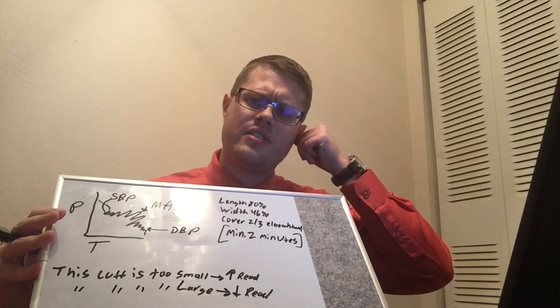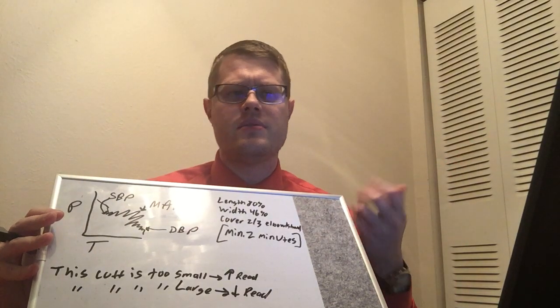The cuff with its tubing connections obviously shouldn't leak. You should know what that sounds like. Also, you're going to put it on probably differently than what you're used to at first, because you're at the head of the bed, so it's kind of upside down. You want the place where it attaches facing you, face up, so you can disconnect it in a hurry, like when you're getting them out of there. If the cuff is too small, the blood pressure reading will be too high. If the cuff is too large, the reading is going to be too low.